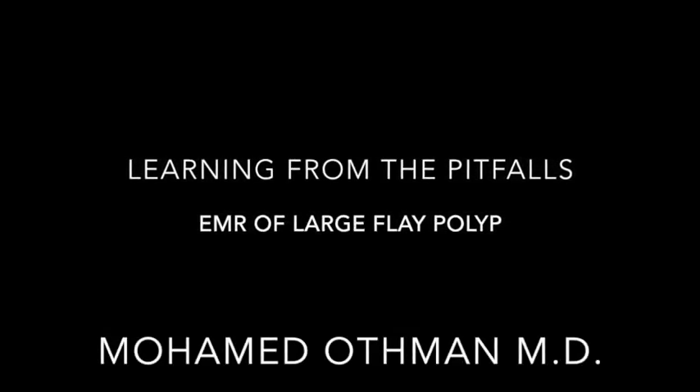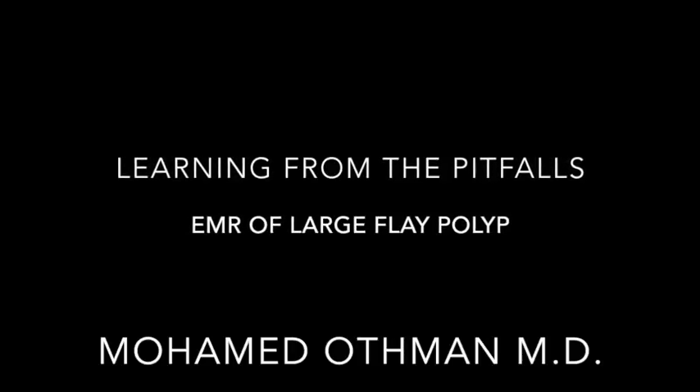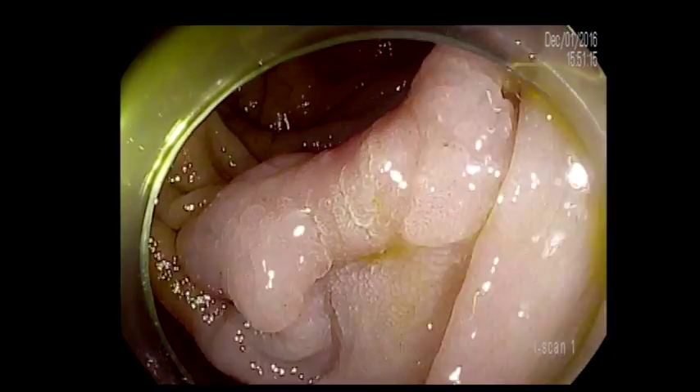Welcome back. In this video, I will discuss some of the mistakes that could happen during EMR, and I'm going to use one of my cases that I did recently.